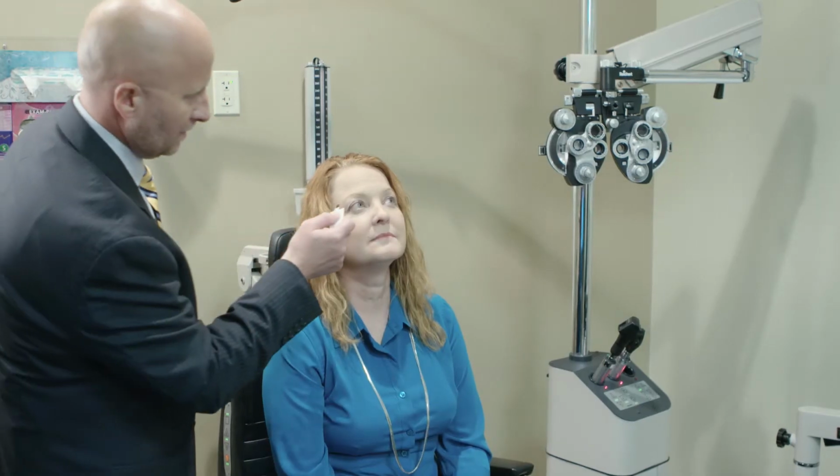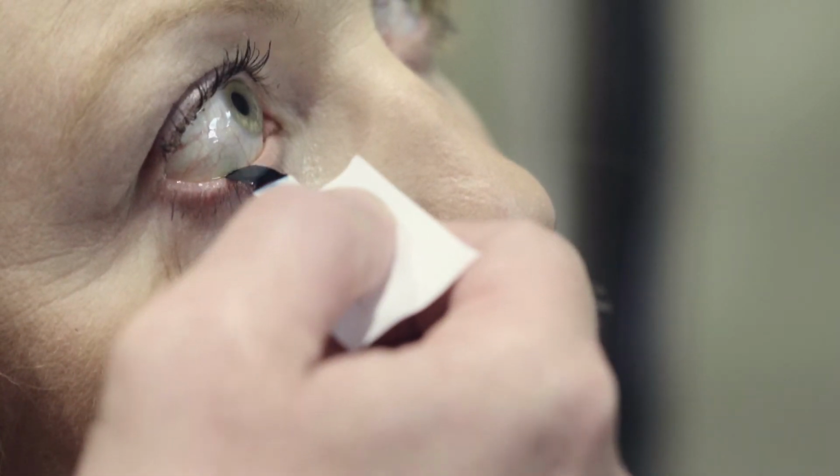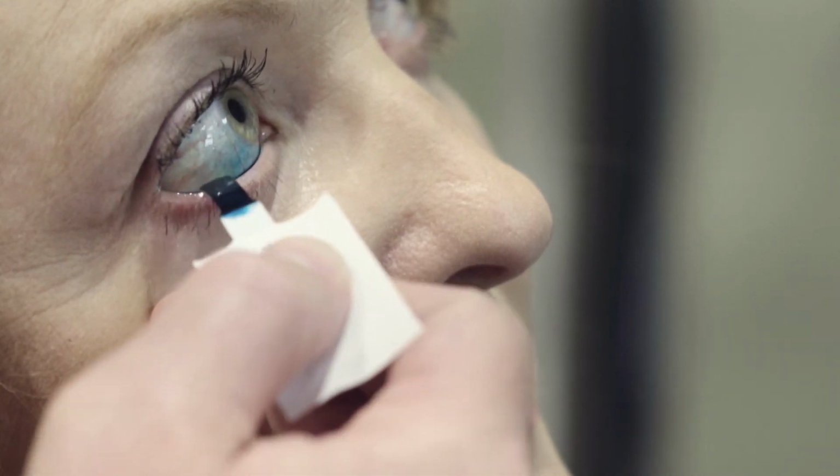Next, we're going to use Lissamine Green to look for any signs of irritation on your eyelids. We are going to evaluate the patient's conjunctival surface and the lid wiper area to look for signs of conjunctival irritation and lid wiper epitheliopathy. This will stain other areas of the ocular surface that are damaged or irritated, which fluorescein may have missed.